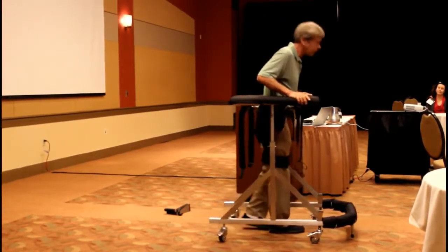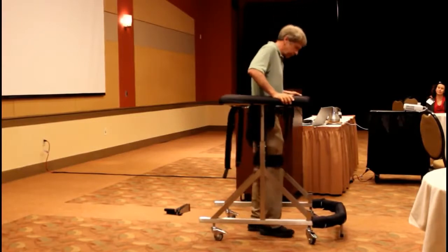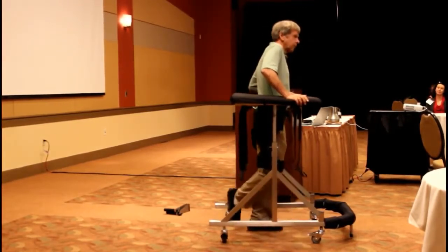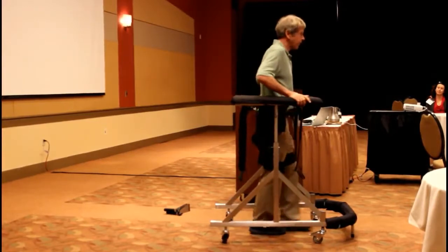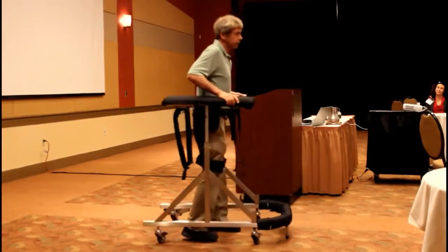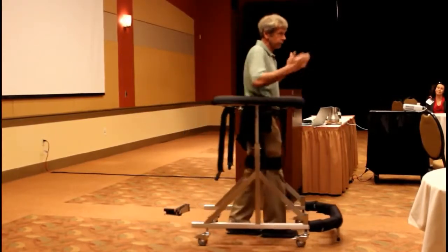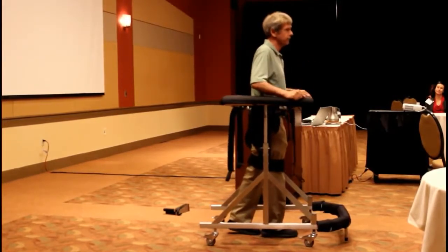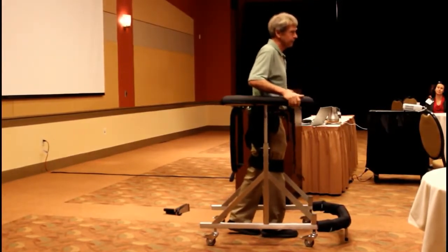Or it also has an inline capability. So if you wanted to just diagonally press the two wheels in the front and the back, it'll lock it straight. So initially, if you have someone with a brain injury and they're going side to side, now you have it straight for them for their early therapy sessions until they get stronger, and then challenge them some more.